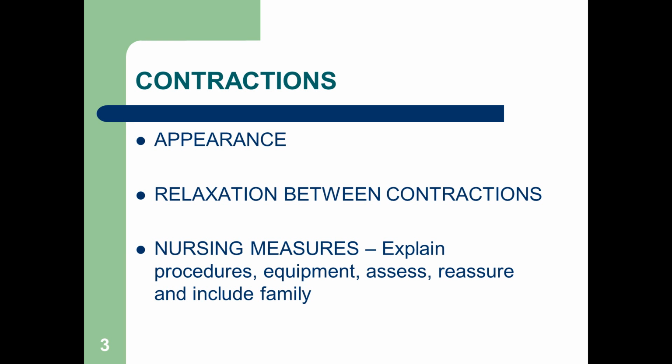We want to see relaxation in between contractions because that gives the uterus a chance to recover, okay? Constant contractions, constant stimulation is not good. It can lead to rupture and fetal distress. Nursing measures, certainly we're going to explain the procedures, any equipment such as the monitor. You're going to assess, reassure, and include the family. Okay?